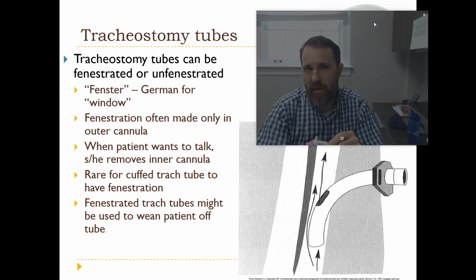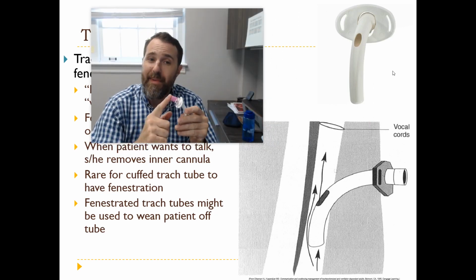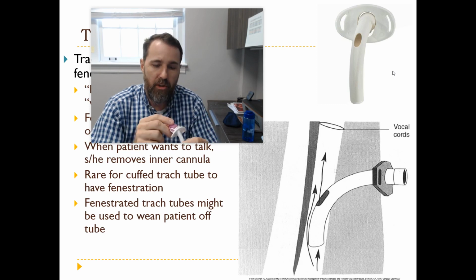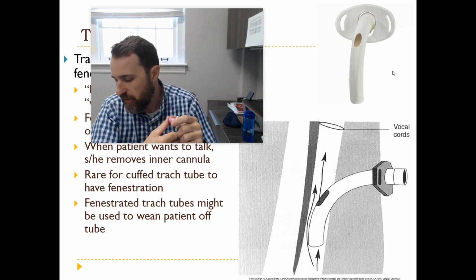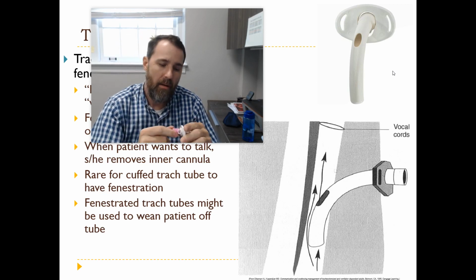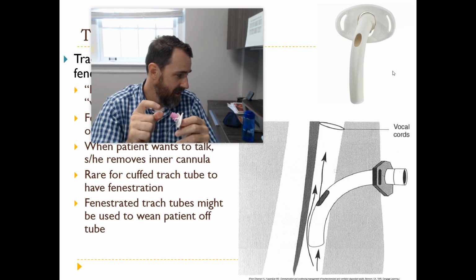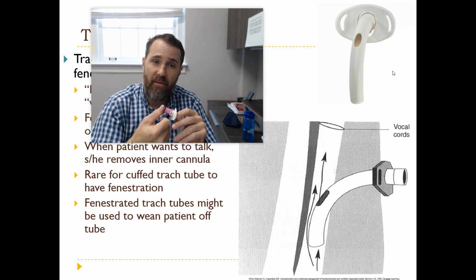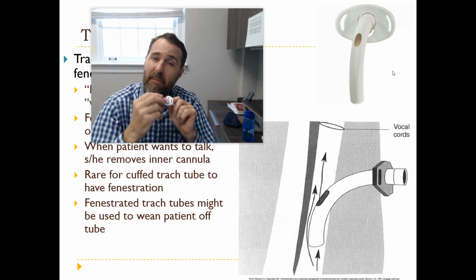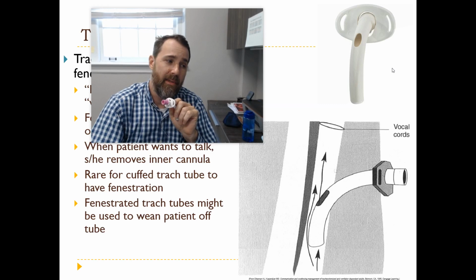And we can't really go any further without talking about the tracheostomy cap. So the tracheostomy cap is essentially exactly what it sounds like. I don't have one here, but all trachs come with them. It's essentially the cover that pops on and it completely occludes the tracheostomy tube.